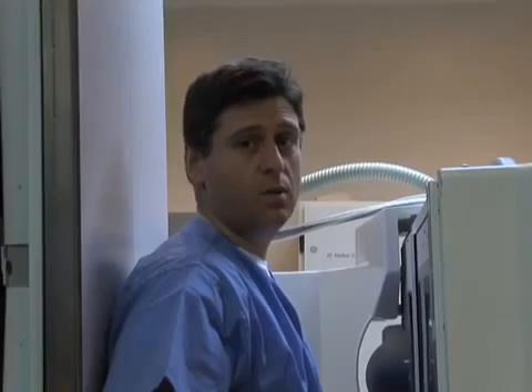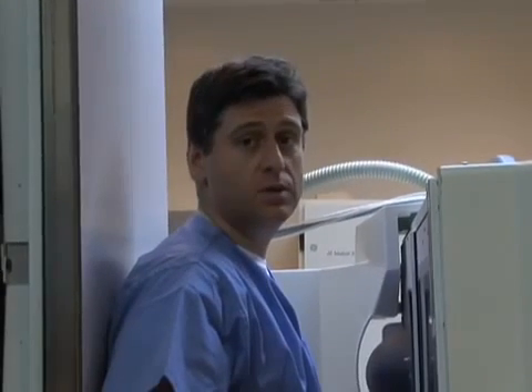Hi, I'm Dr. DiPirio with the Bariatric Medical Institute of Texas, and today I thought I would demonstrate what it means to have a barium swallow. This is something that we often order on patients, either pre-op or post-operatively, and so I thought I would demonstrate this this morning.